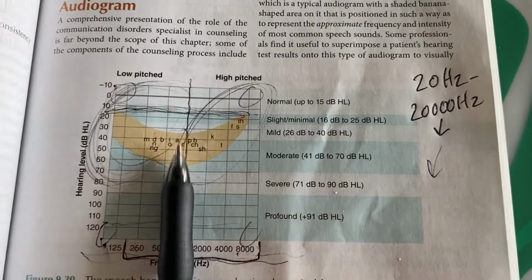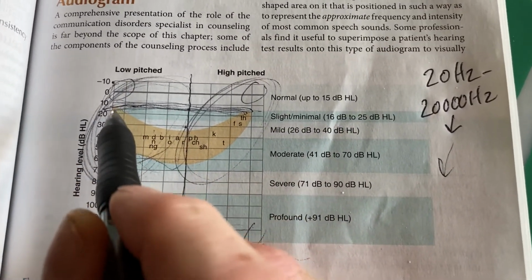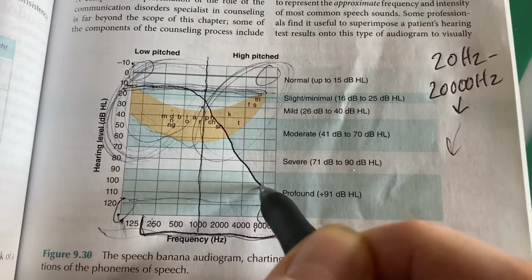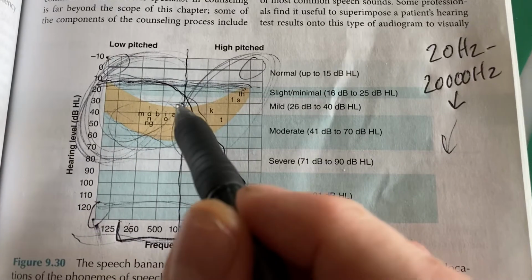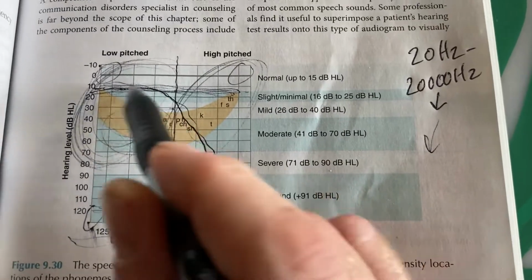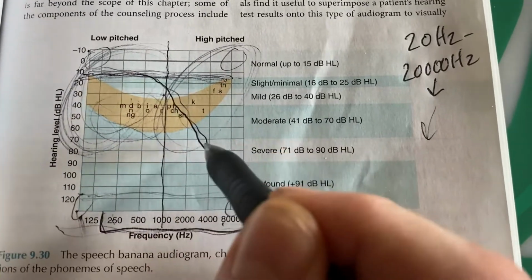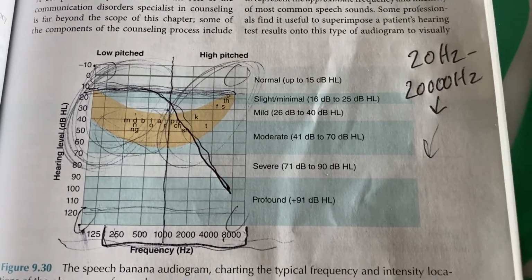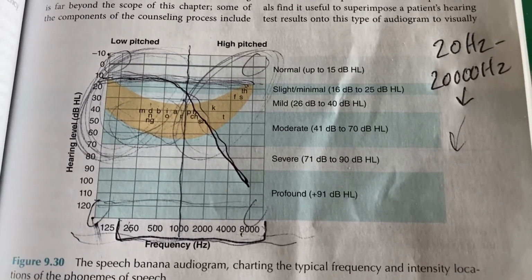The designation right here at 1000 hertz is important to note too, because most people with an age-related hearing loss are hearing just fine here and then fall off here, meaning they can hear voiced phonemes, but they can't hear the unvoiced ones. Speech ends up sounding loud to the patient, but not clear. It's almost as if speech is like a radio dial that's not quite tuned in. It's a little off. You can hear the announcer, but you can't understand what he or she is saying.